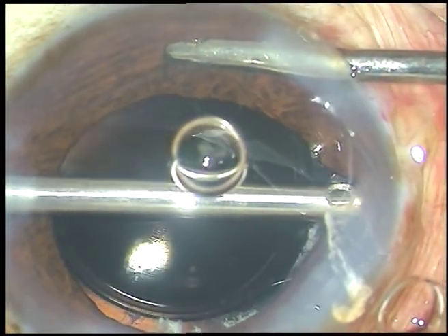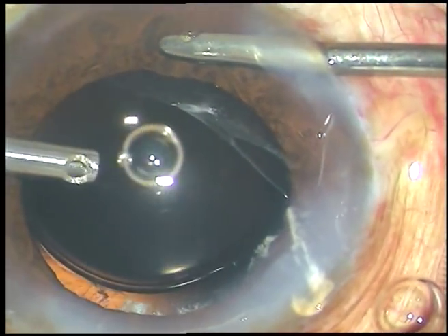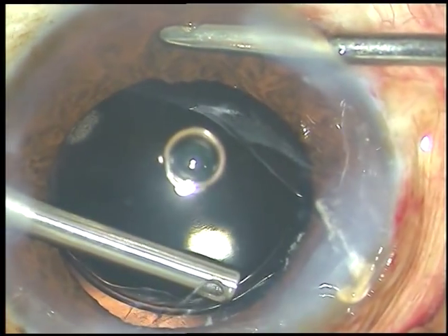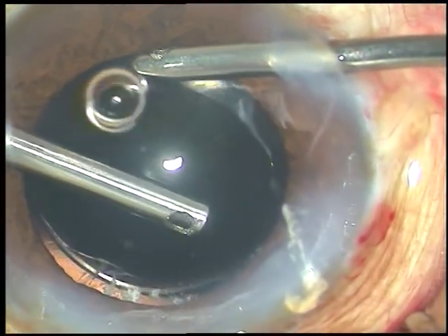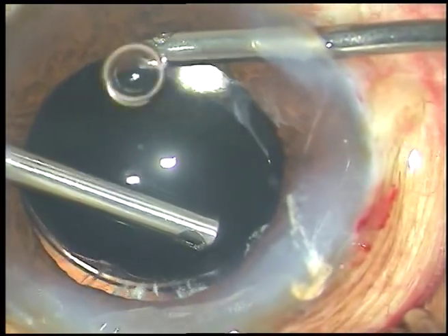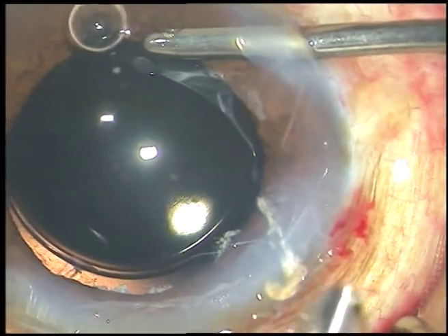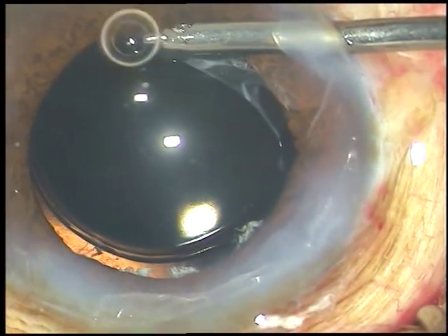Like this. Once the portion of the strand that is incarcerated in the main wound is free, if you just depress the posterior lip of the main wound, it will come out. Nice shaving and trimming of the vitreous strands are being done. The bag is nicely supported by the capsular tension ring. I depress the posterior leaf and the vitreous strand comes out.